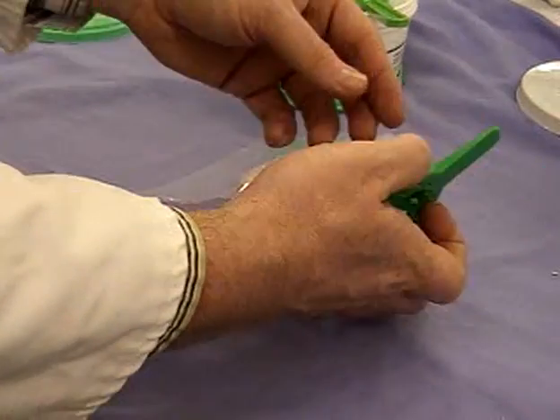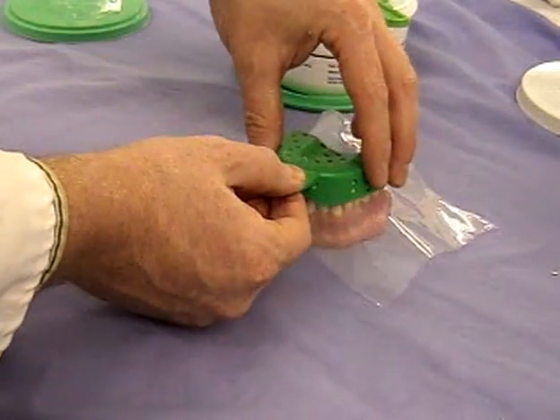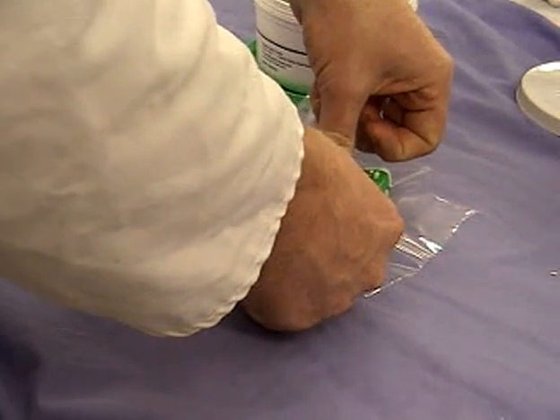That sheet of plastic — just one sheet — is going to stop the material going into all the undercuts between the teeth and leave us the space for the low-viscosity material to go in afterwards.